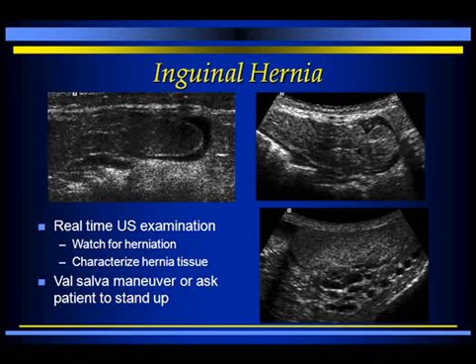Another topic, talking about painful groin. Sometimes the doctor has trouble making the diagnosis on clinical exam. I feel a mass there. I'm not sure if it's a hernia or not. I'm not sure if I really feel something coming down. Well, ultrasound is a great extension of the physical examination.